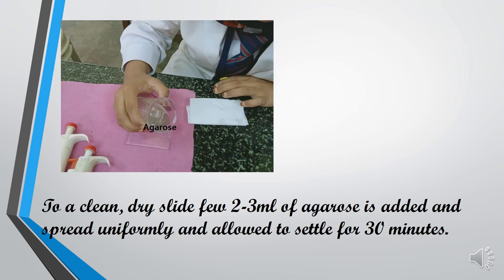Prepare 1.2% agarose in 1X assay buffer. To a clean dry slide, 2-3 ml of agarose is added and spread uniformly and allowed to settle for 30 minutes.